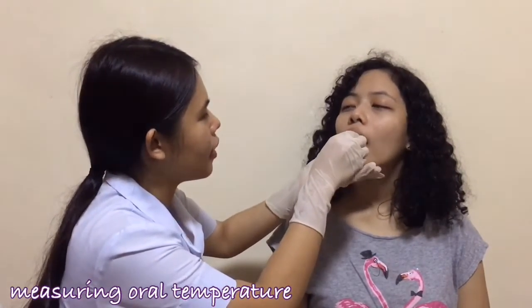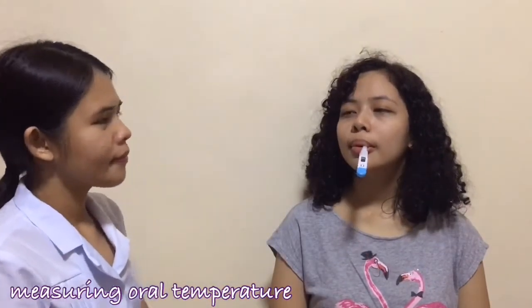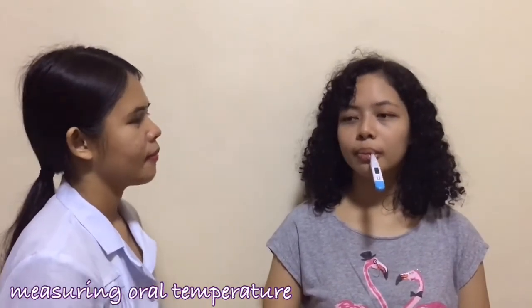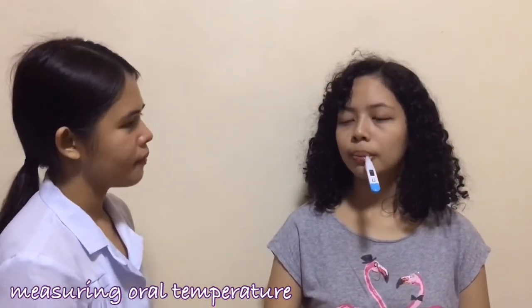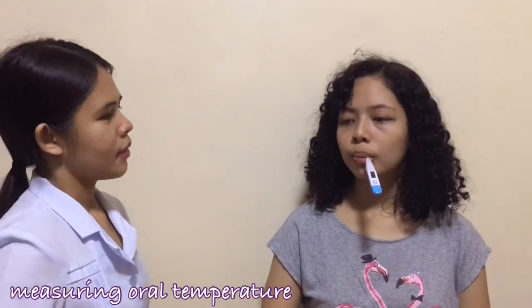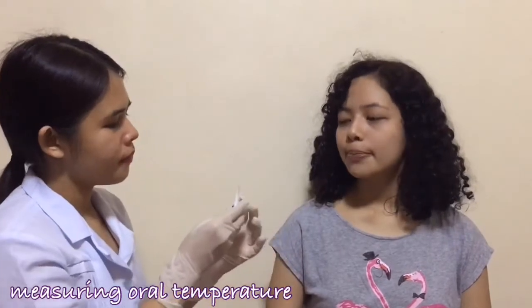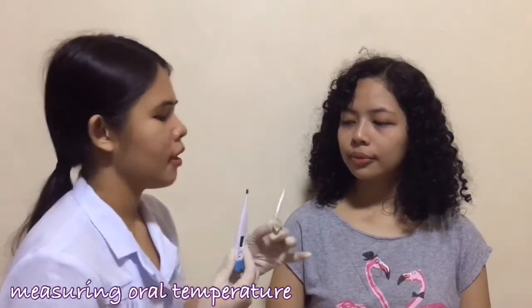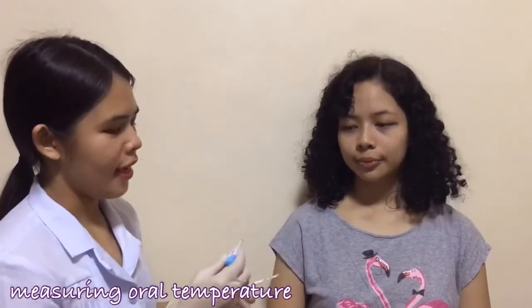You can now close your lips and wait for it to beep. Your temperature is 36.3 and it is normal.